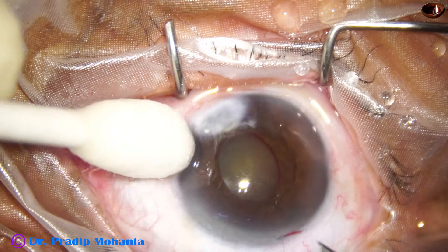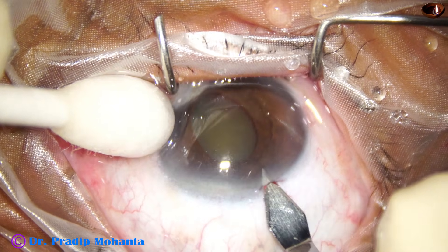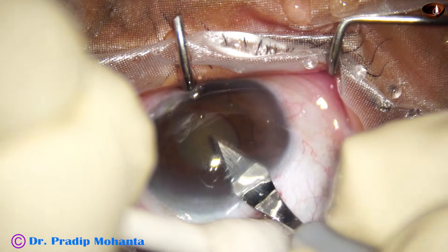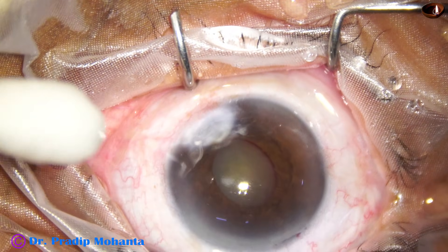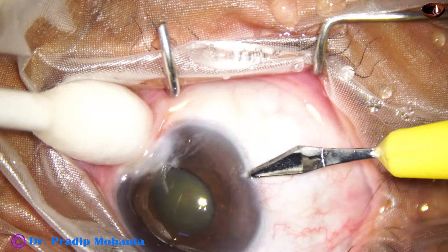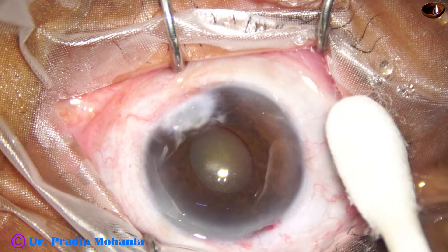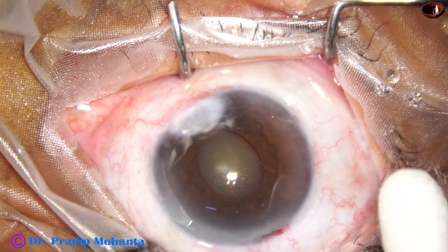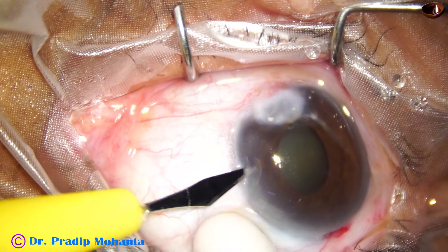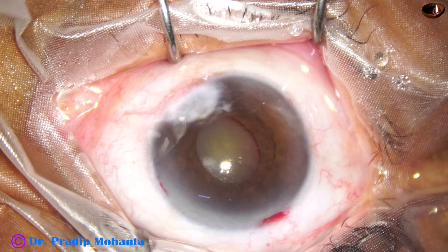The pupil is not dilating well because of adherent leukoma. The patient is a 55-year-old lady. She has adherent leukoma in both eyes, probably because of vitamin A deficiency in childhood. Probably she had keratomalacia, which she somehow recovered from, and this adherent leukoma happened.